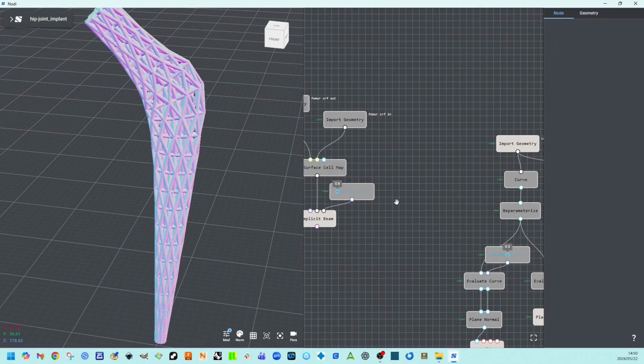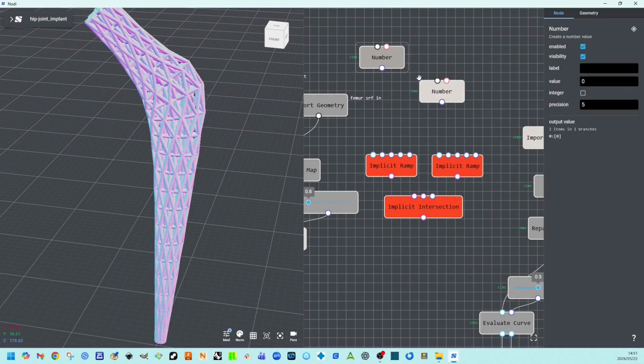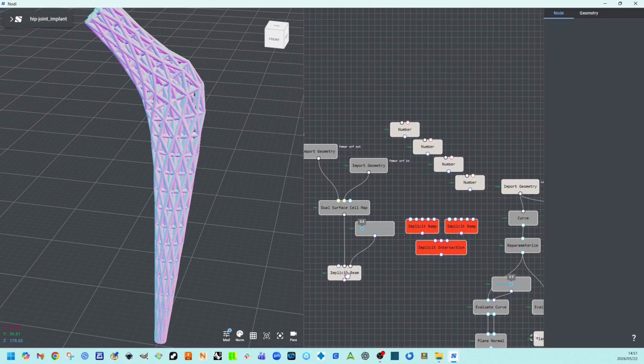To grade the lattice density from sparse to dense, we add 2 implicit ramps and an implicit intersection. Each ramp creates a scalar field that fades as you move away from its plane.